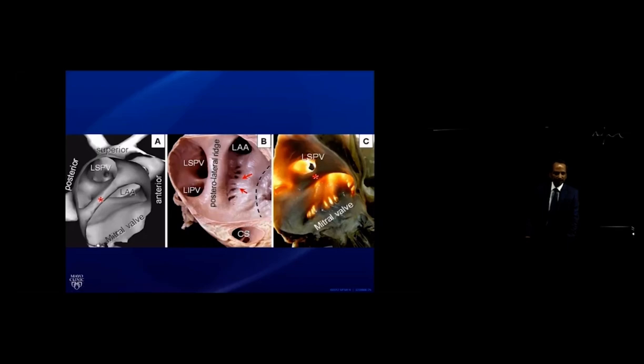It's not so much the muscle acting as a shunt, although that is possible. It's more likely that that's the place where it's cooling. So that's where we have the gap, and that's where we need to put the catheter and ablate. There are other ways to get around that issue, like occluding the coronary sinus, which can temporarily cause cessation of that flow, and we're able to ablate in that location.